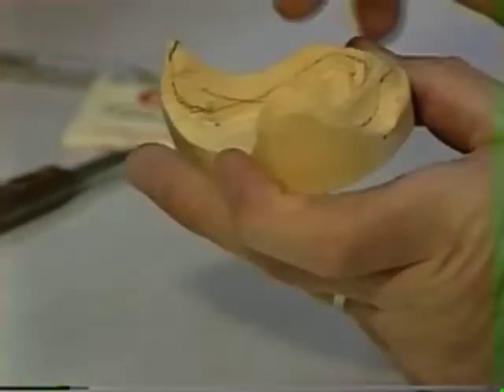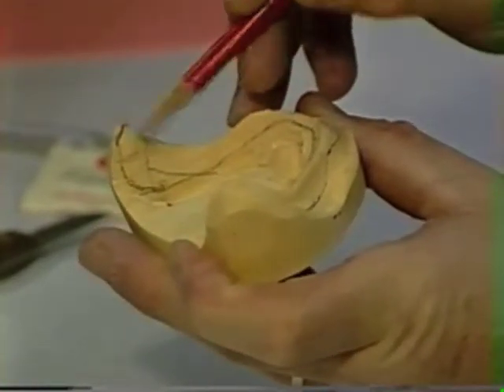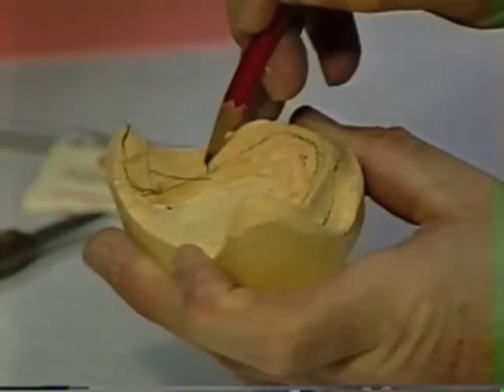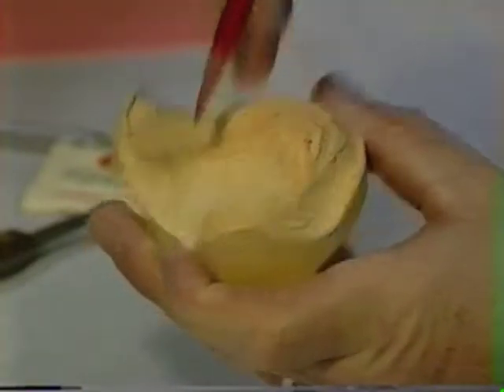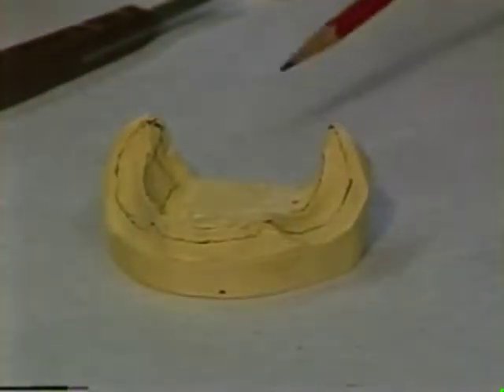And we do the same thing on the other side from this area, the distal of the mylohyoid line, which is usually about the mesial of the retromolar pad, to just anterior to where our tray is going to be crossing the mylohyoid line. And we're going to place an extra layer of wax here, an extra layer of wax here, and then we're going to put relief wax over the entire cast after we place that extra relief for the mylohyoid area.